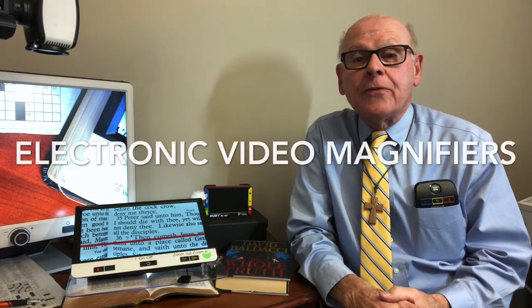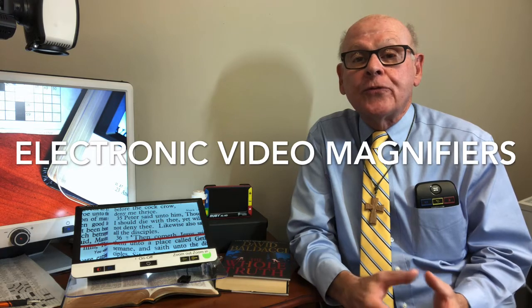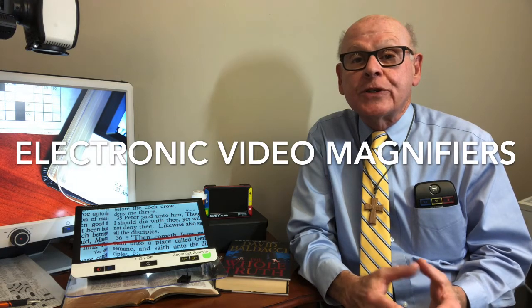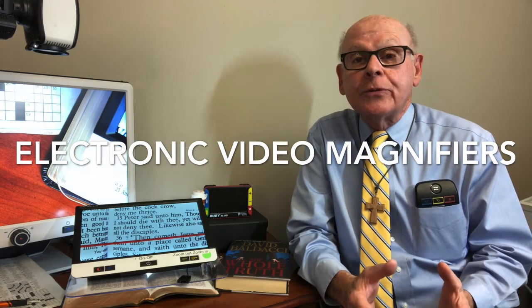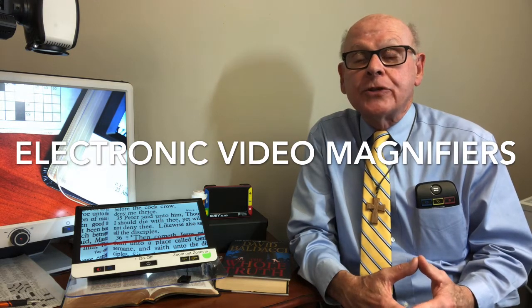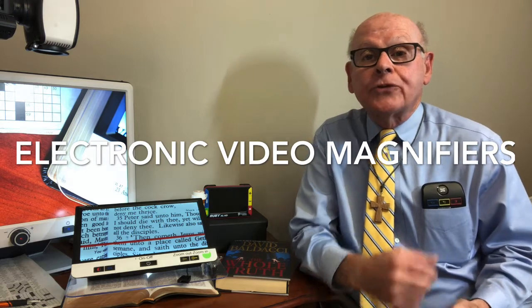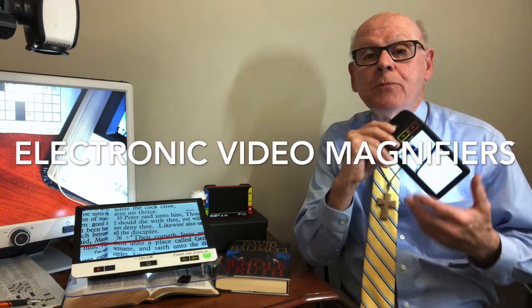There are a large number of electronic video magnifiers that are useful for people who have reduced vision. I'm going to show you some of them that I find work especially well for my patients and that I've had quite a bit of experience with. We'll start with the smallest and most portable of them.